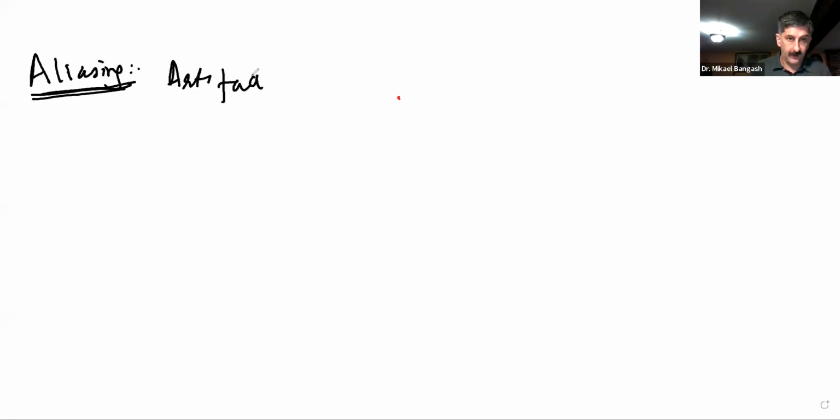Hey, ladies. So today we're going to be talking about aliasing. And first of all, it's okay. Aliasing is going to be an artifact of Doppler.